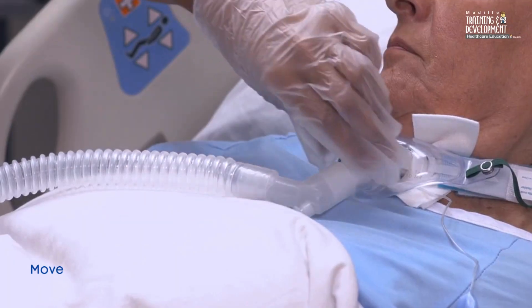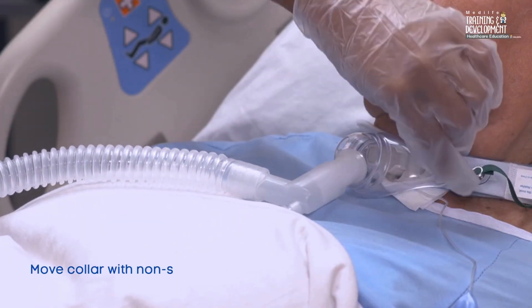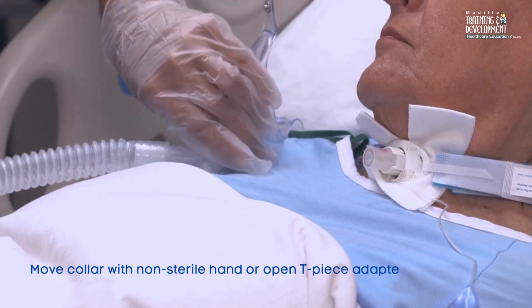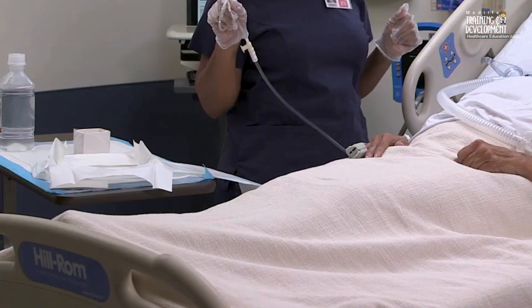If the patient has a collar over the tracheostomy tube to deliver oxygen or humidification, move it with your non-sterile hand. Alternatively, open the T-piece adapter.